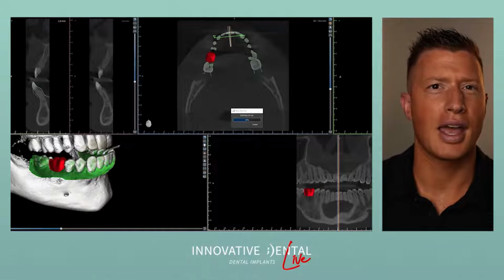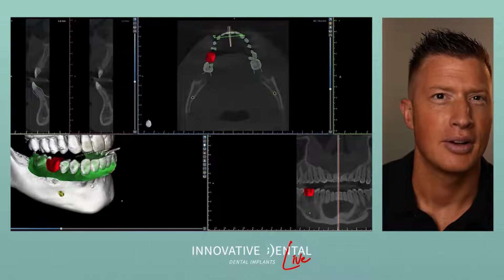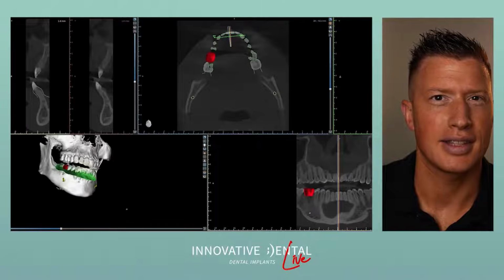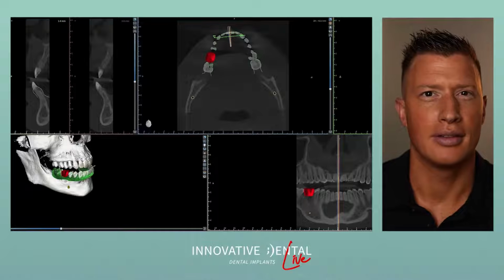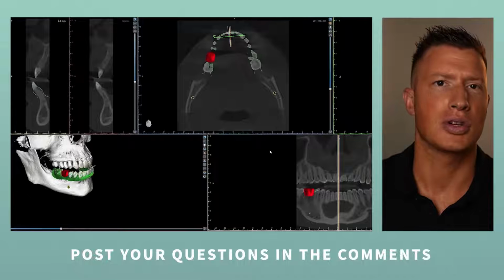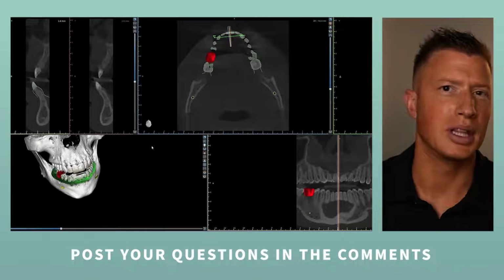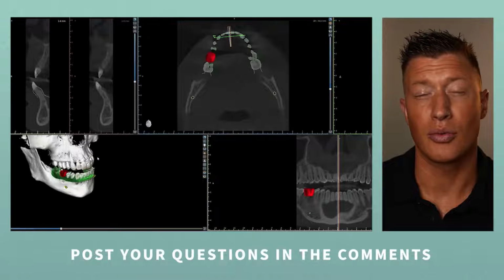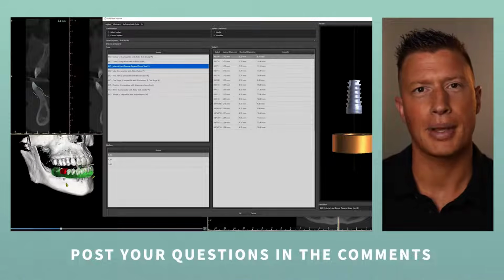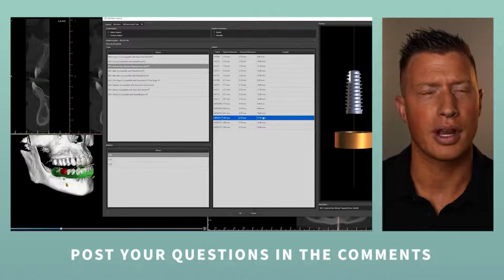So right here, I'm going to go ahead and draw the nerve. The software is going to plot the placement in yellow of, there you go, you can see it. Now we've got lower nerves, right and left, and we can see where we need to avoid definitely placing an implant. If you were to place an implant into this site, the patient's going to lose all the feeling in their lower left jaw, some muscle control even, and maybe have a droopy lip. And so obviously a really significant issue. We definitely never want that to happen. And with this software, it makes it pretty much impossible for that to happen if we're careful in our planning.